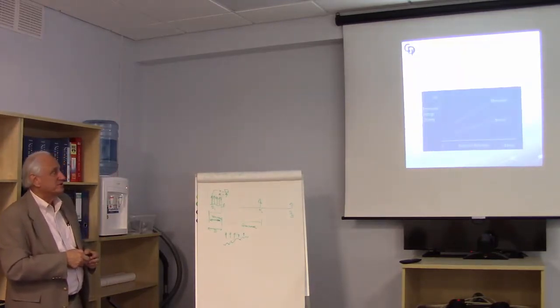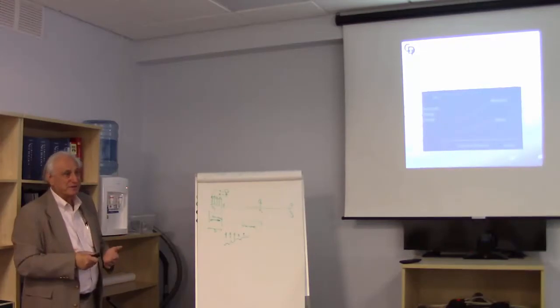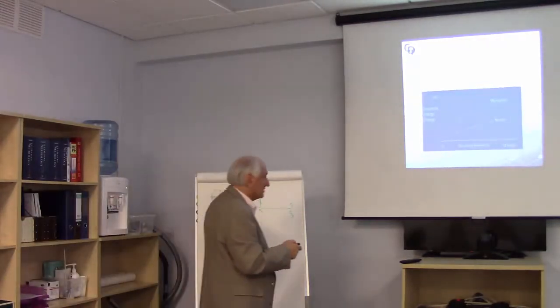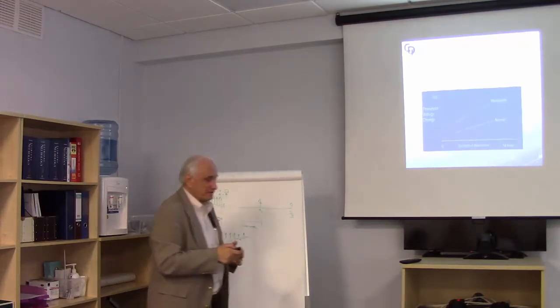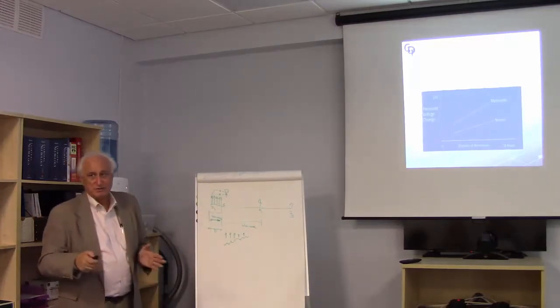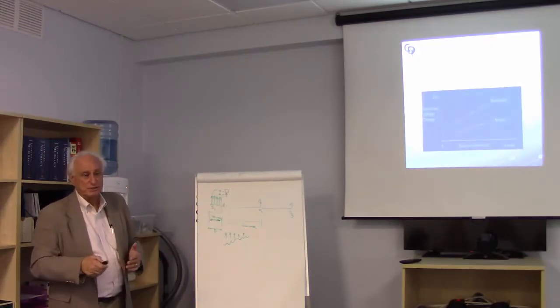The other thing which is interesting and to be aware of is this phenomenon called anesthetic fade. So what this shows is the duration of the anesthesia and the threshold voltage change. I don't know how long the operations are that you're involved in, but we do many operations that go 10, 12, 14 hours.